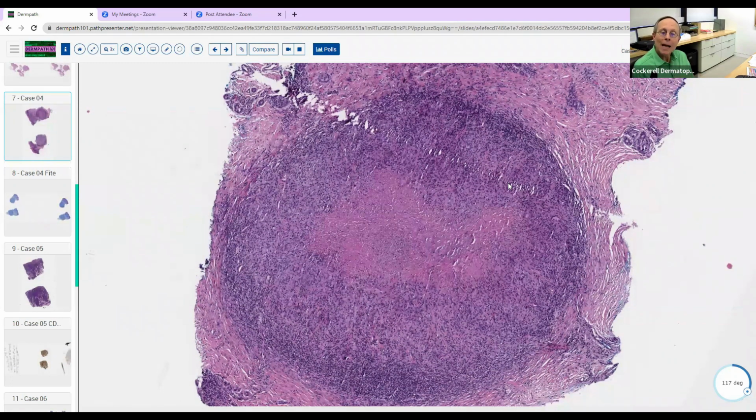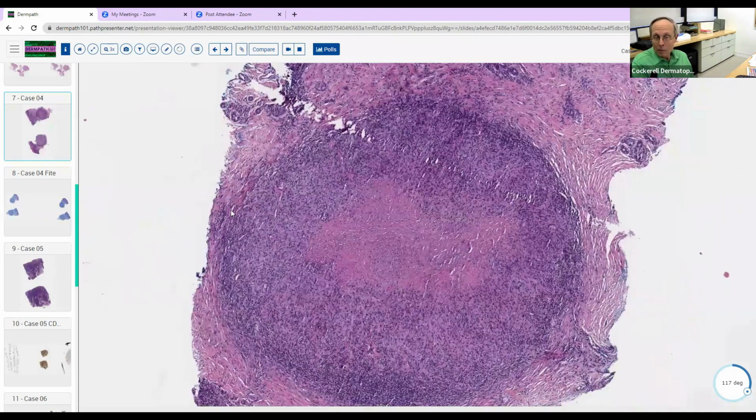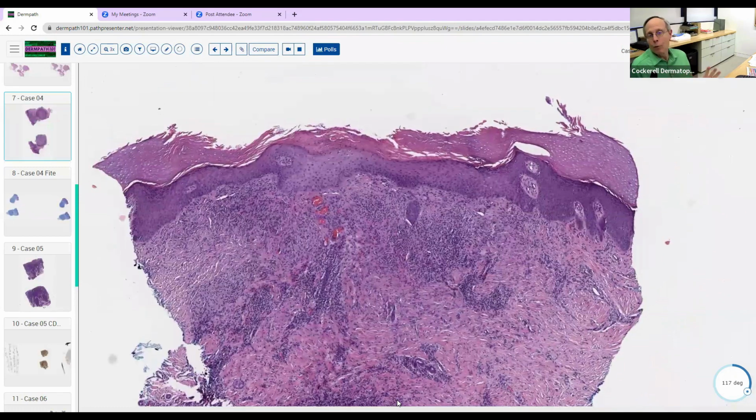What's the more common pattern with deep fungal infections? A non-caseating usually, or just a deep inflammatory infiltrate? Well, they usually give you more of a suppurative granulomatous dermatitis, lots of neutrophils with multinucleated histiocytes, a much more brisk inflammatory reaction. And then usually they're seen up in this area with marked pseudoepitheliomatous hyperplasia. So this is a better pattern for atypical mycobacterial or cutaneous tuberculosis. Now, there's one type of TB that can give you more of that suppurative granulomatous process with pseudoepitheliomatous hyperplasia.